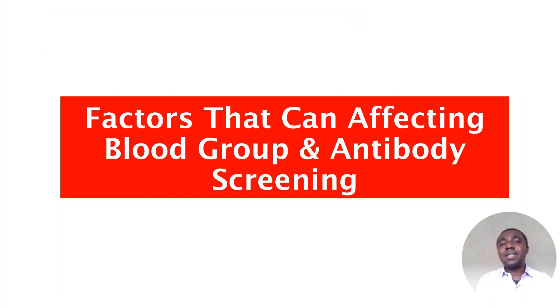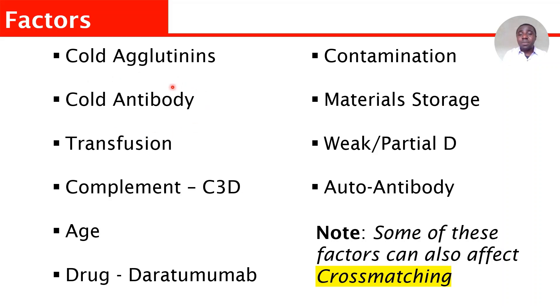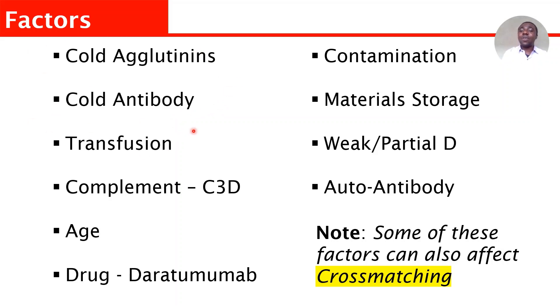Let's look at the factors that can affect blood group and antibody screening. Number one is cold agglutinins. Cold agglutinins can affect it — if you haven't watched my video on cold agglutinins, go and watch it. In terms of cold agglutinins, some antibodies react better at cold temperatures. If you are running blood group and antibody screening incubated at 37°C, you might get negative results — that does not mean the antibody is absent; it is a cold antibody. You can see this mainly in terms of cold antibodies.